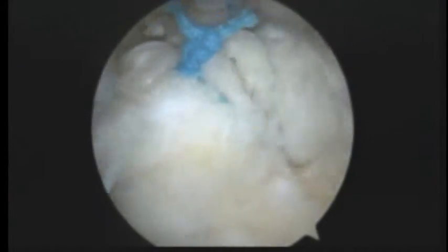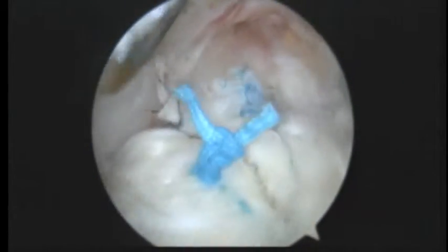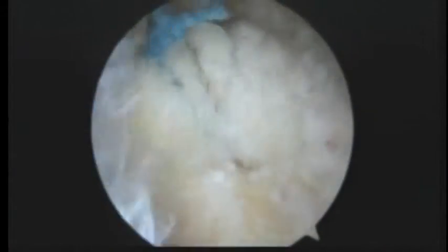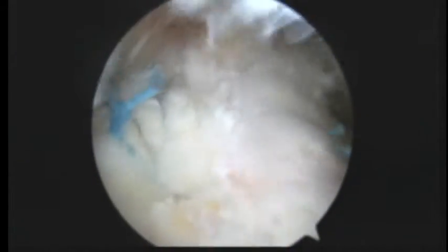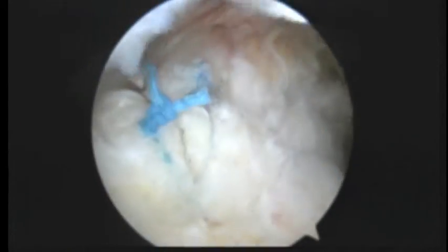Okay, we're all done. It's been about 25 to 30 minutes to get this all fixed. We've got two anchors in and six stitches and one side-to-side stitch, and we've got that completely anchored back to the bone. I'm very happy with the way that looks, and hopefully that'll heal and do the trick for you. So good luck to you now. Bye-bye.